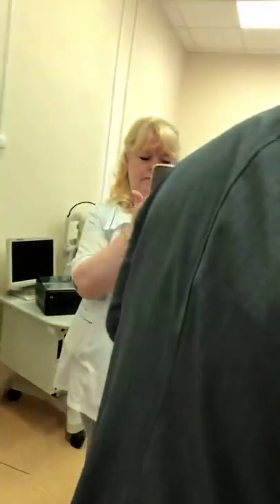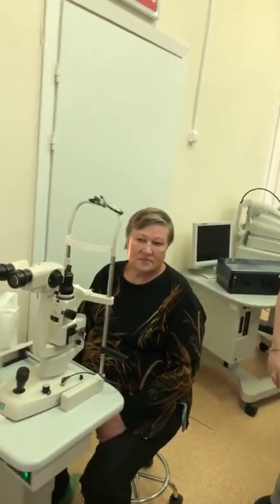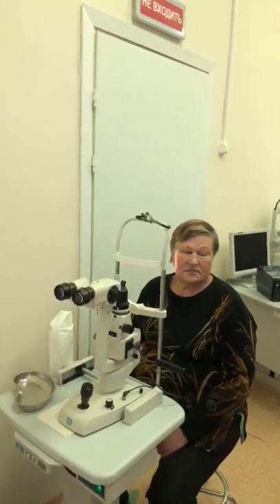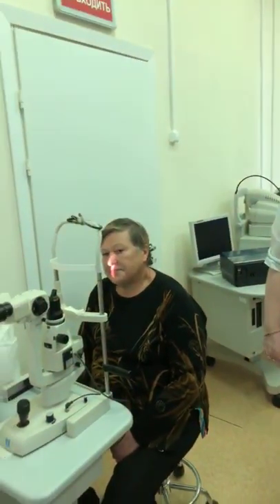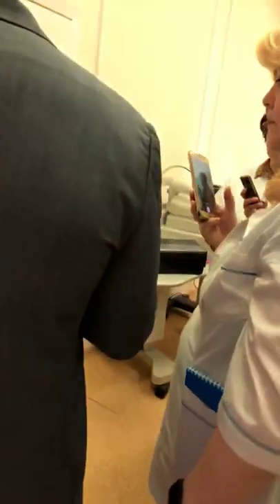We ask how we need to disinfect this. You don't have to. It's self-disinfecting, so the light is disinfecting it for you. The main thing is right after you do the IPL, you just wipe it clean. You need to clean it right away, before anything dries on it.